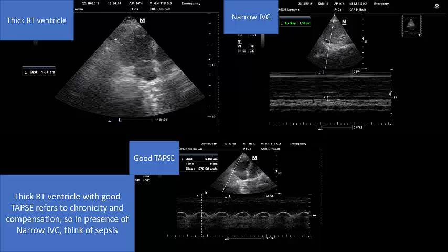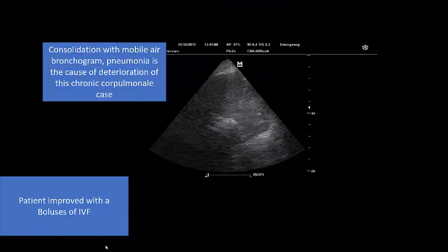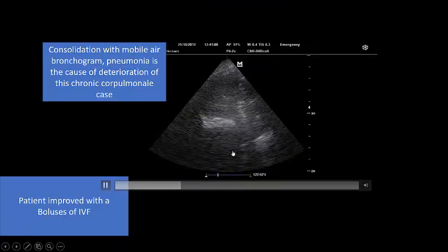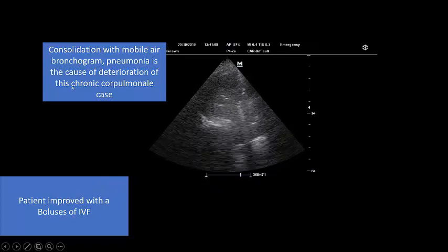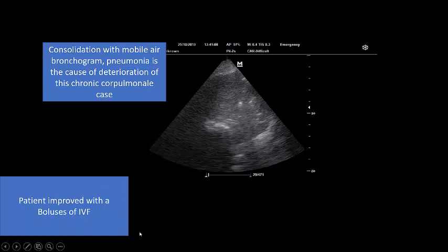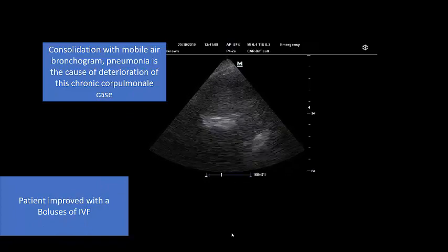This is typical chronic cor pulmonale. Our patient has morbid obesity with obstructive sleep apnea, which has been causing cor pulmonale for a long time. A thick right ventricular wall with good TAPSE refers to cor pulmonale with compensation. With a narrow inferior vena cava, we should think of another cause of hypoxia and hypotension — and sepsis is a very important consideration. When we went to the lung, we found very bad pneumonia with consolidation showing mobile air bronchogram. Pneumonia was the cause of deterioration in this chronic cor pulmonale case, and the patient improved with IV fluids.